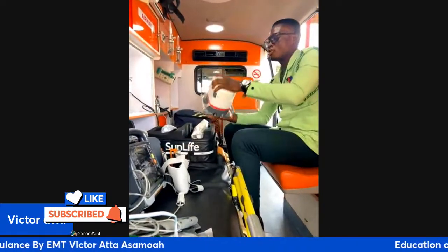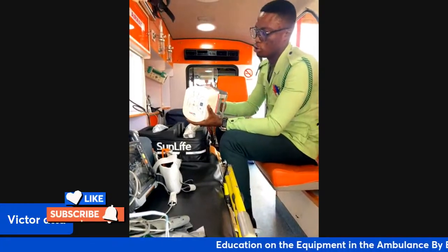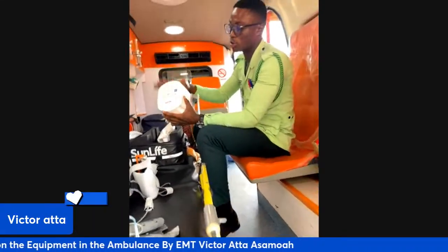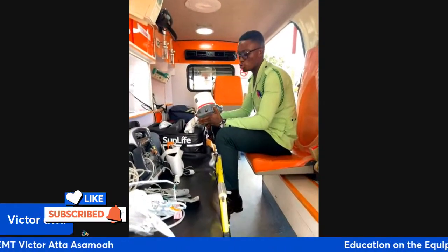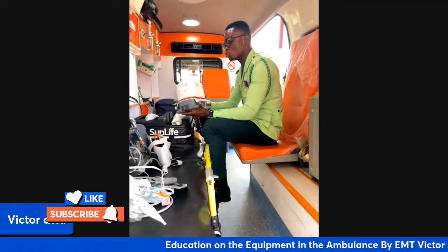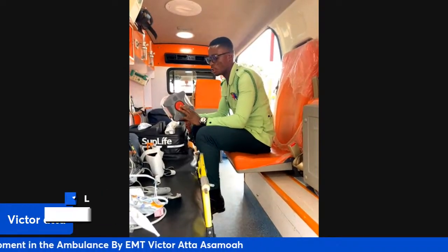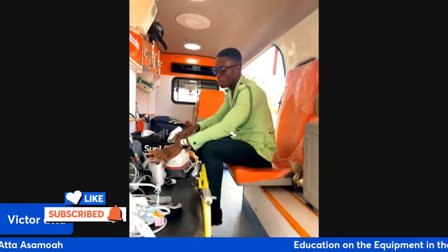Okay, so this is the automated chest compressor that's used for chest compression when you're doing CPR. When you're doing chest compression on a patient who is unconscious, this machine will help you a lot. It will allow you to regain your energy. It also gives the accurate depth when you're doing the compressions. Okay.